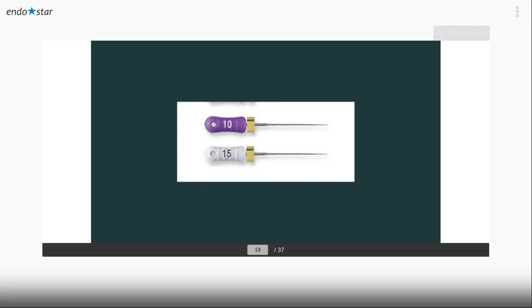So what can be done to expand the initial glide path? Yes, there are unique sizes like 12K available. These files are always helpful, but we need to realize that in the clinical scenario, if we are using the 10K hand file as our patency file, we have already gone 1 mm beyond the apex, and that has already made the apical size to ISO size 12.